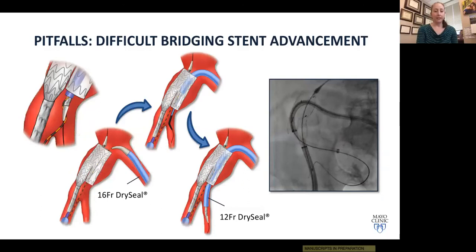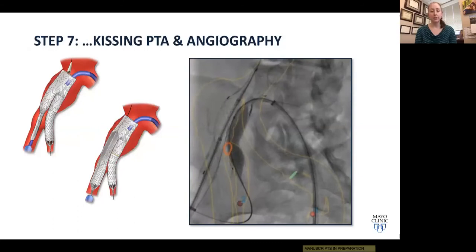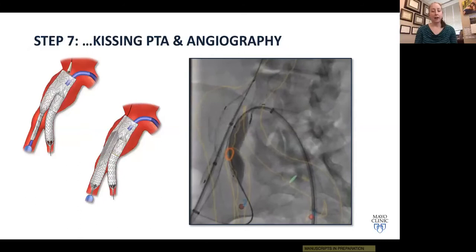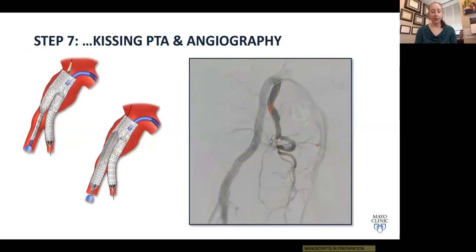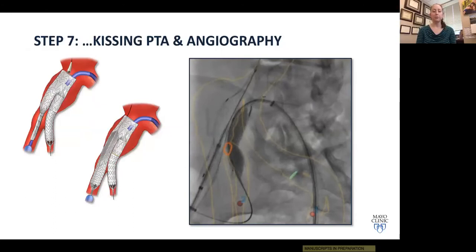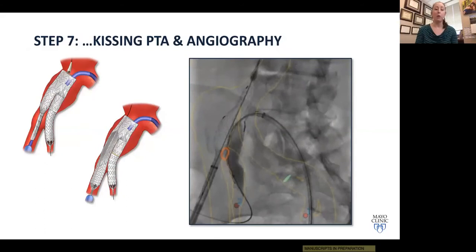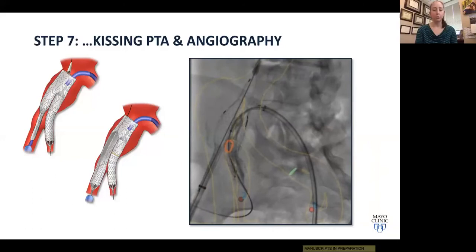We then perform kissing balloon angioplasty using a 14x2 balloon and shoot a completion angiogram. It's critical at this step to confirm you don't have a type 1B endoleak from the internal iliac, because soon you'll move on to the next step and lose wire access to the internal iliac. Fixing an endoleak now — simply by extending the repair — is far simpler than having to recannulate later. If everything looks good, move on to the next step.